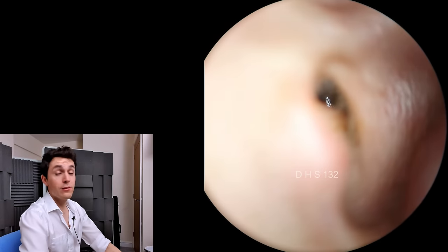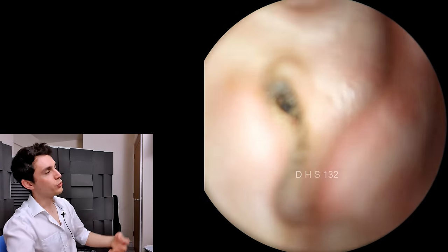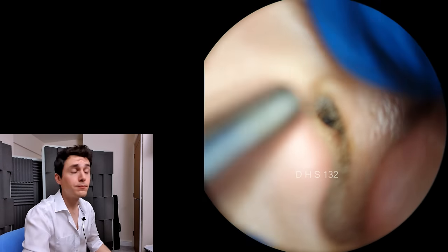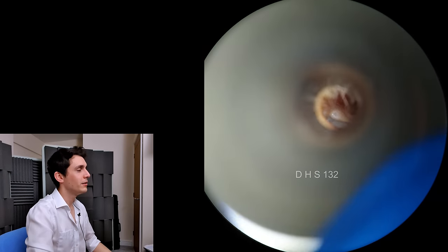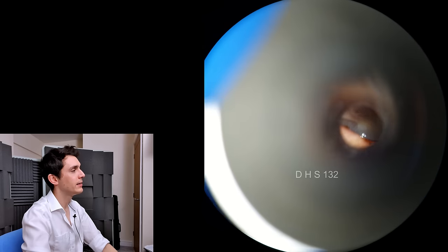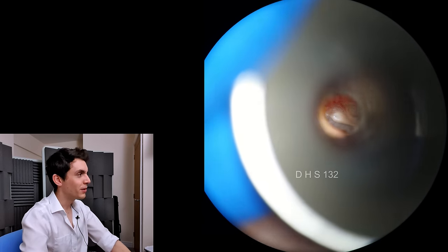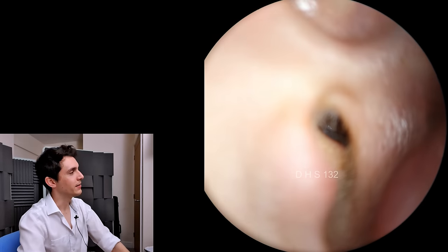We see a little bit of wax in the ear as well, which is what we're trying to achieve with these dry removal tools and suction. I've just got the patient to tilt their head away from me and I'm examining the handle of the malleus in greater detail. There's a little bit of redness around the attic region, but I'm not overly concerned about that.